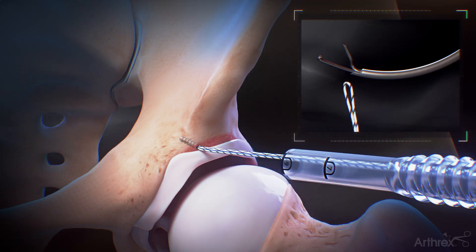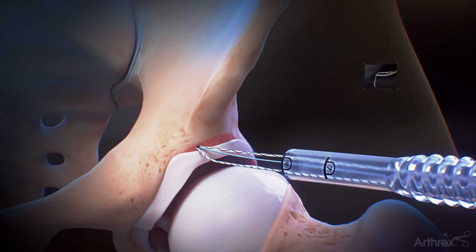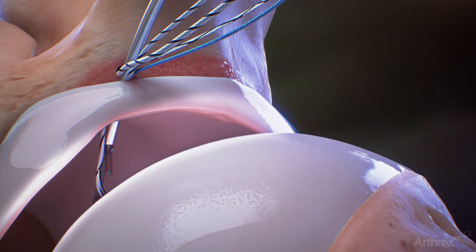Load the looped end of the shuttle suture into the jaws of the swift stitch suture passer. Use the swift stitch to pass the suture through the base of the labrum and release it into the joint space.